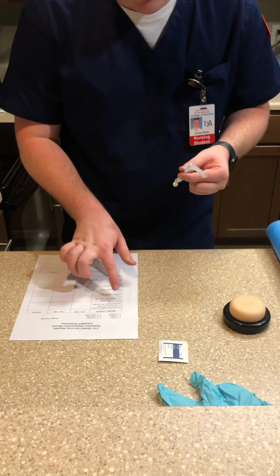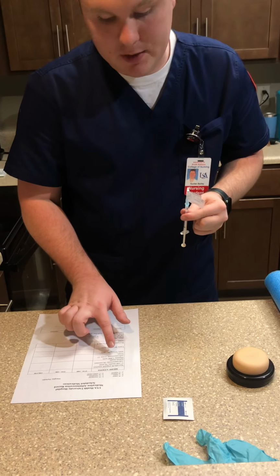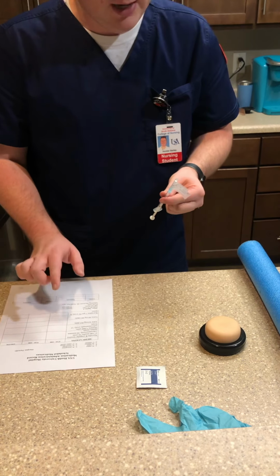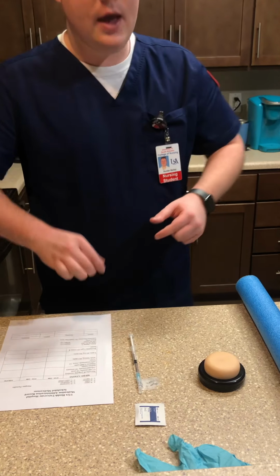The right drug is heparin. I have heparin. The right dosage is 5,000 units, and I have 5,000 units. I'm going to be giving this subcutaneously every 12 hours. So that's the right route and the right time, and now is the right time. So now what I'm going to do, sit this down, and I'm going to explain the procedure to the patient.